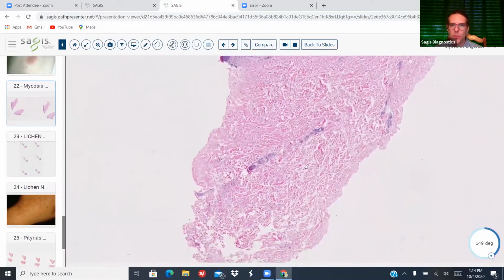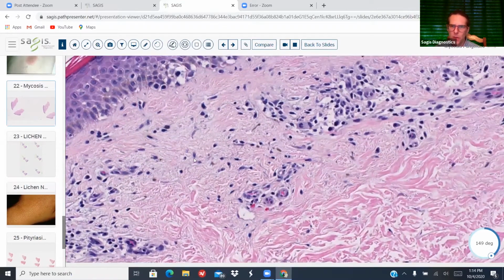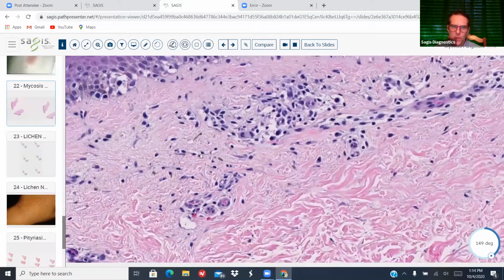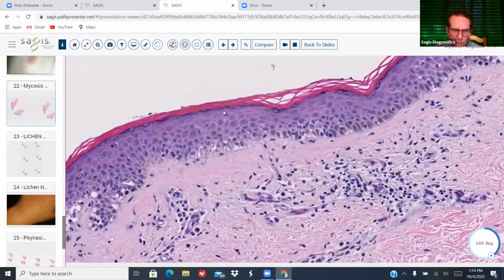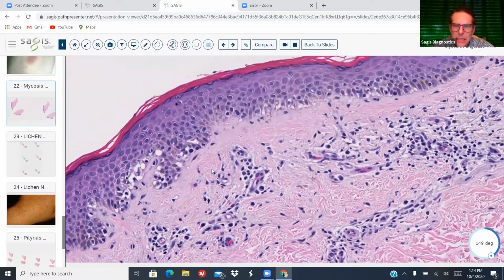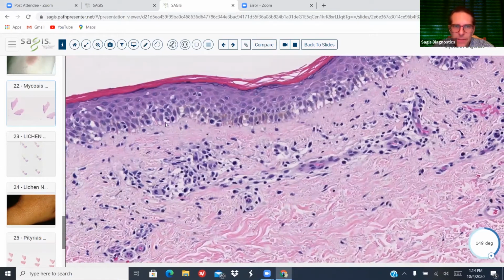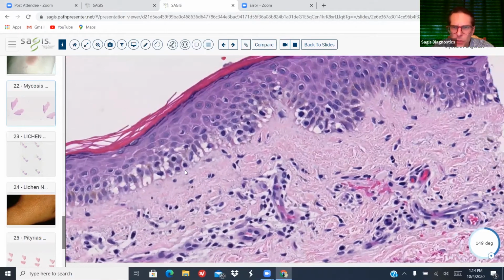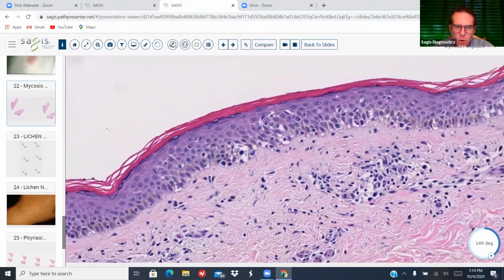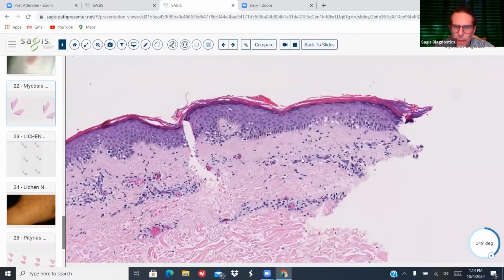Okay, so we have a superficial only infiltrate. The infiltrate is composed of mostly lymphocytes, a little bit of extravasated erythrocytes. There is some pigmentary incontinence. And now let's look at the epidermis for necrotic keratinocytes. I see a lot of vacuoles, but I don't see many necrotic keratinocytes. I don't see any. And I see a lymphocyte in many of the holes, and these lymphocytes are a bit enlarged. There's a basket weave orthokeratosis above this. Fairly normal epidermal thickness. Papillary dermis is a bit fibrotic.